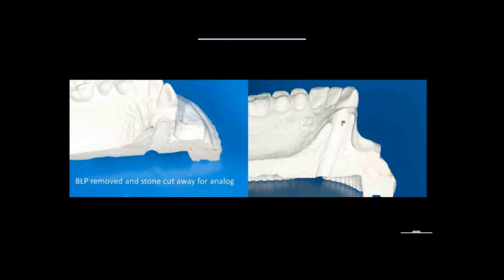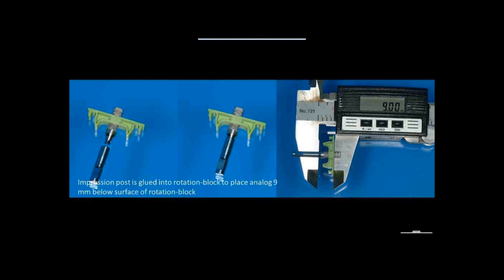I use the analog from the impression post and glue it into a rotation block so that the top of the rotation block is 9 millimeters above the top of the implant — that is the prolongation. Noble Biocare uses this prolongation as standard; Straumann uses H2, H4, H6 — two millimeters more or two millimeters less. Some systems have even more leeway. This is a fixed prolongation. I then place the analog in there and use integrity — the temporary crown material — to capture the analog in exactly the position where the future implant will be.